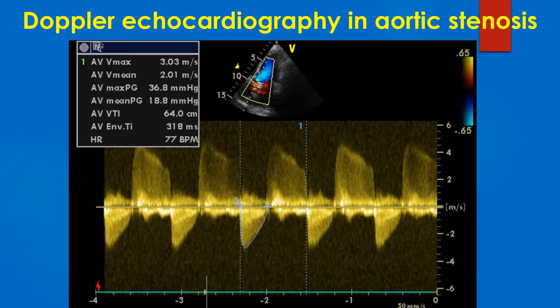In the image, the peak velocity is 3.03 m/s and mean gradient is 18.8 mmHg. By mean gradient it is mild aortic stenosis, and by peak velocity it is moderate aortic stenosis. We might report it as mild to moderate aortic stenosis.